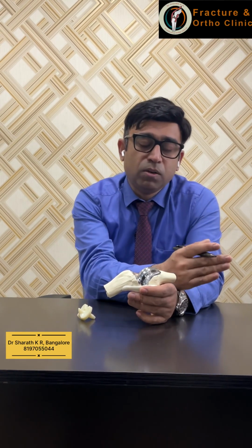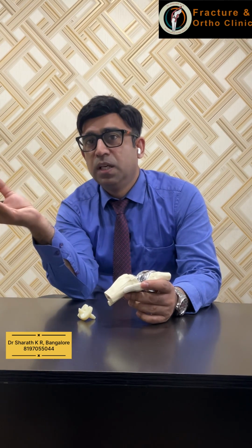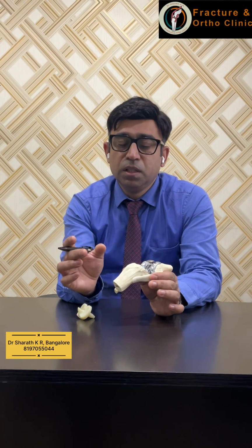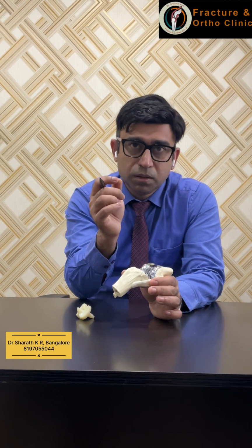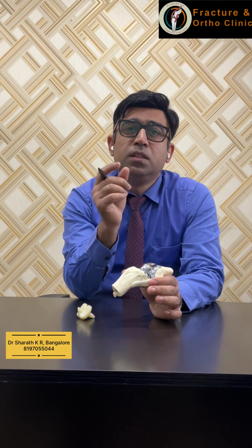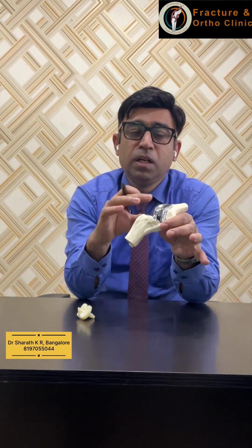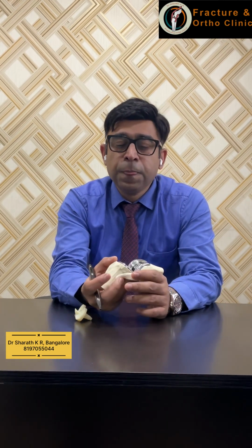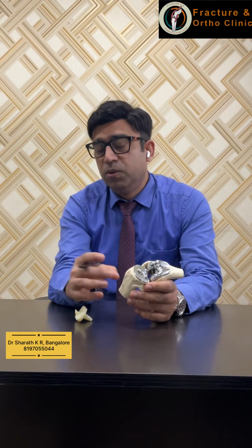So with this in the background, what are the things we do during surgery which certify it to be called personalized alignment? Personalized alignment in simplified terms means that surgery is done specifically based on the particular anatomy of that particular patient, not a one-size-fits-all approach. That means little small changes we do during surgery based on the anatomy of that particular person. That's why this is called personalized alignment. Here let's see what we are doing.